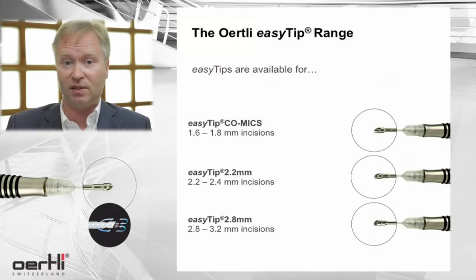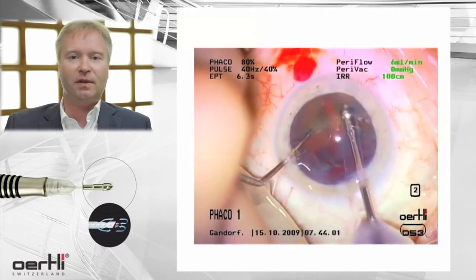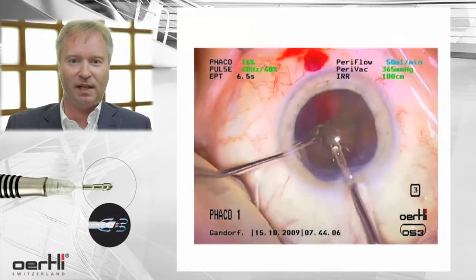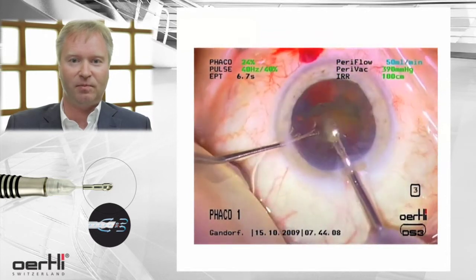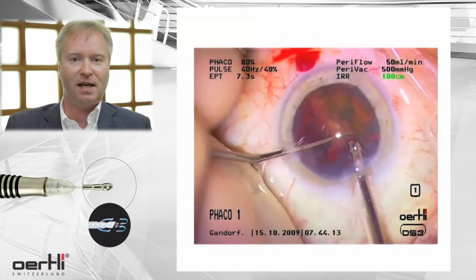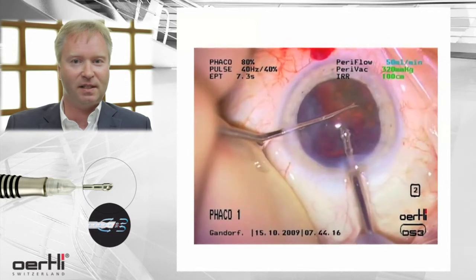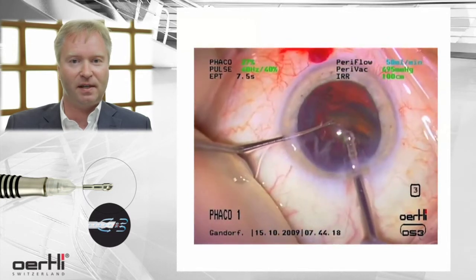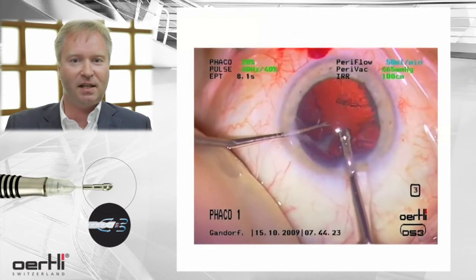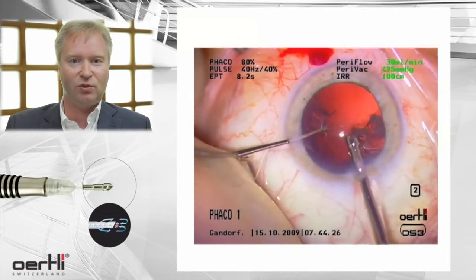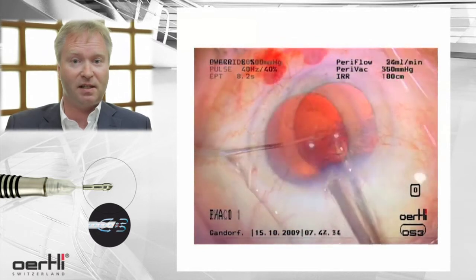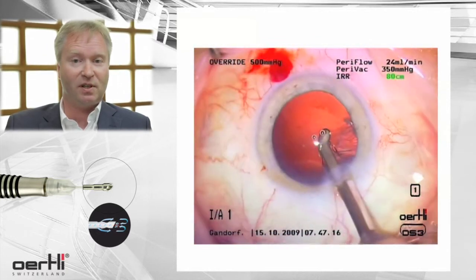On this video you can see how the fragments are magnetically held and locked to the tip of the EasyFaco tip. You can also see how the energy coupling is optimized. The high followability creates a cone of fluid movement to the aspiration funnel, the energy coupling is perfect, and the nuclear fragments are emulsified.